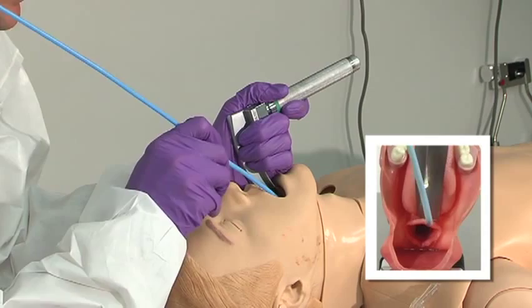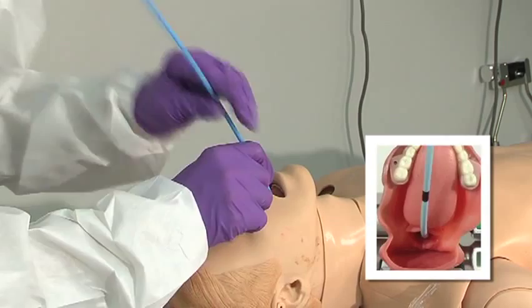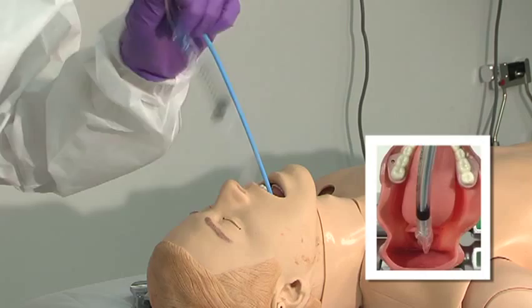If you can't necessarily see the cords, you can then feel the clicking that occurs as the tip of the bougie hits the cartilage rings. Once it's in place, simply slide your endotracheal tube over, using it as a guide.